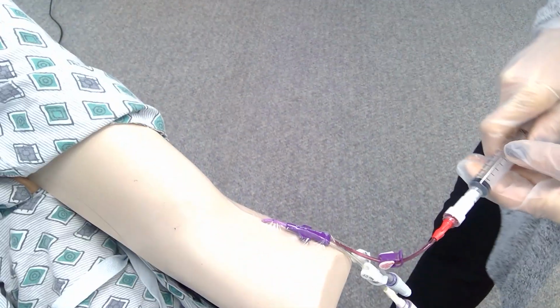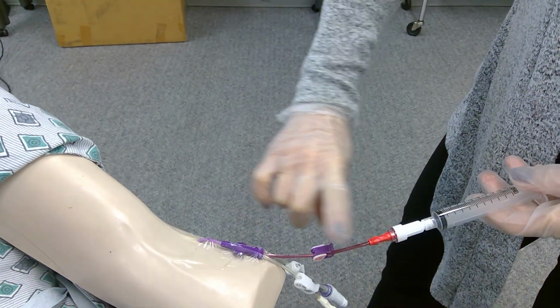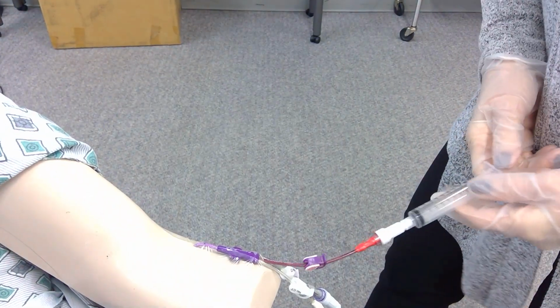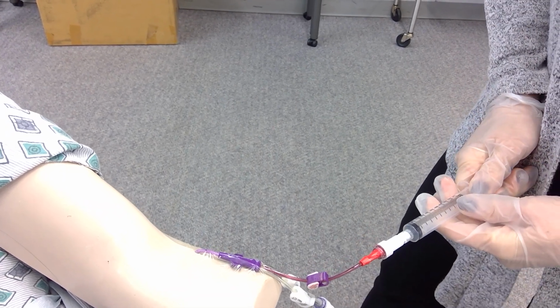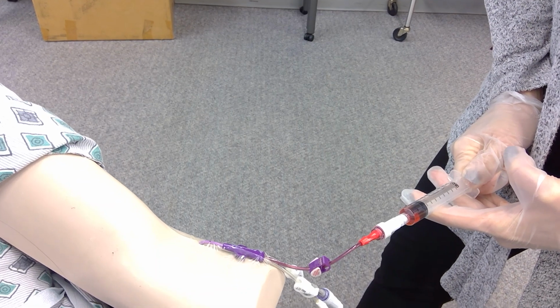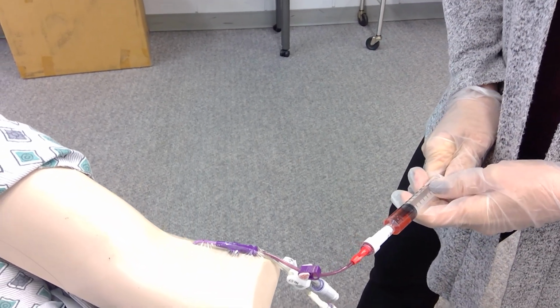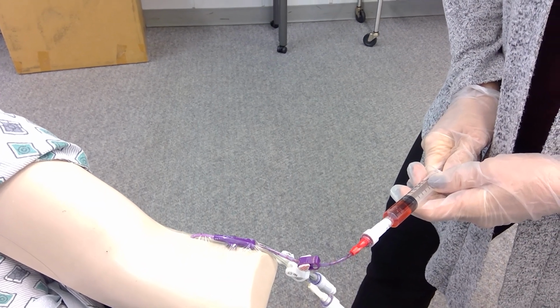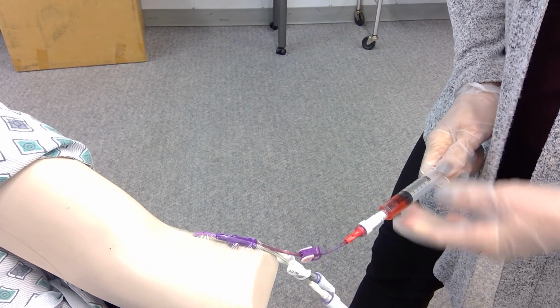You want to waste blood when you're doing a blood draw because you don't want any of this blood that's in the line right now to be sent down to lab. So I unclamp and I pull back, and I should receive blood from the PICC line. Now typically you want to waste at least 5 mLs of blood. So I'm going to draw back until I get to the 5, and that's going to be my waste.